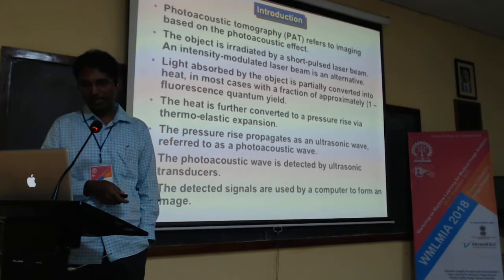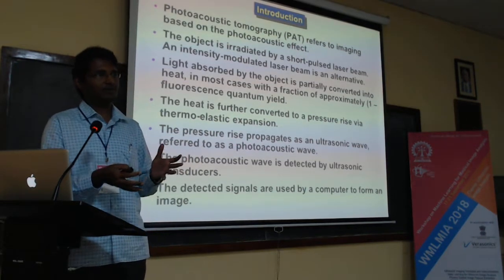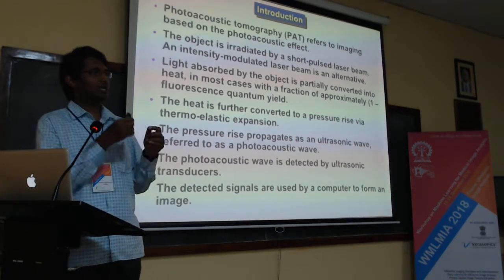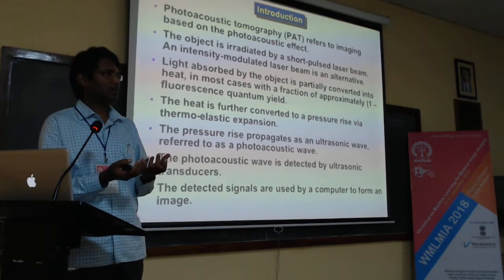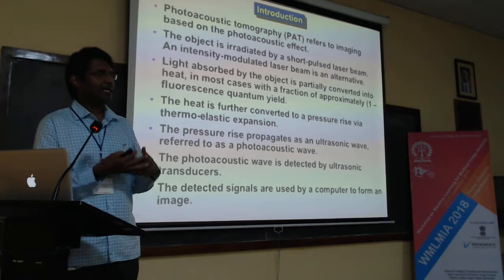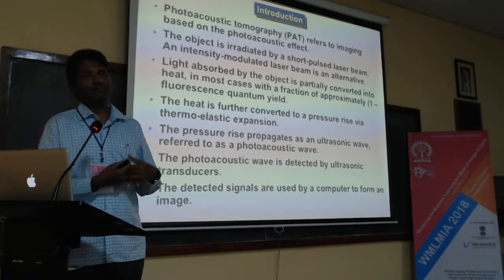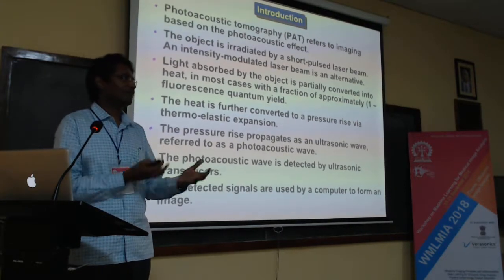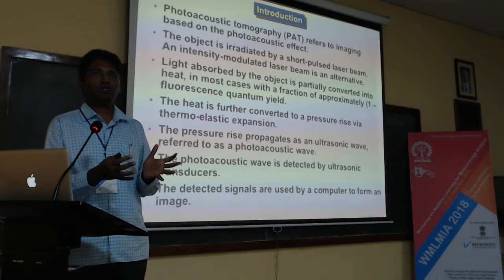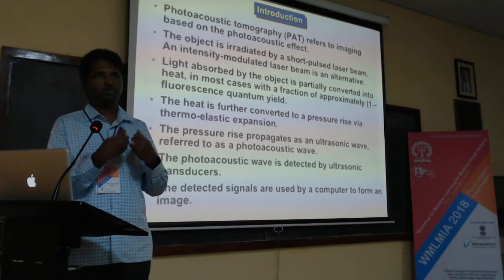So what happens in the photoacoustic effect, at least in the imaging scenario, is that we have an object which we want to image. We take a laser and irradiate the object with it. So essentially we are sending light into the object, and this light energy gets absorbed by the tissue. The light we send is in the near infrared range, between 600 and 1000 nanometers, where the absorption is much higher, so that all the chromophores absorb this energy.